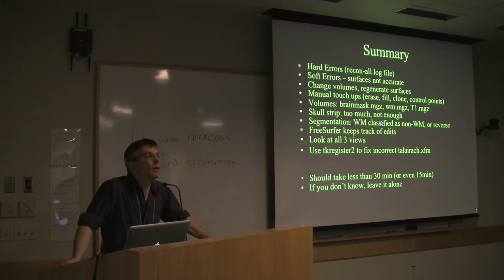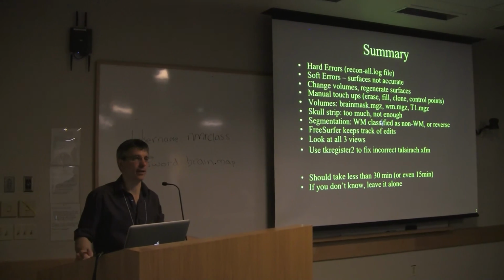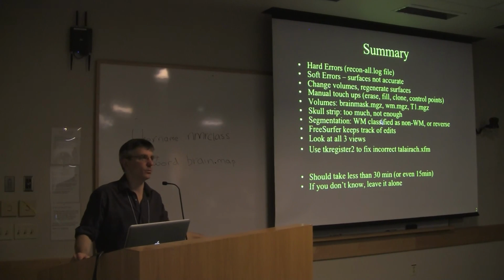Sorry, can you speak up? The version that you just gave is not what you downloaded online, unless I did something wrong. Is there another version of this? Yeah, the version that was online is the version that I usually give, which Doug evidently doesn't like. So we'll get the version that Doug gave online. The version that Doug gave is the version in the book, I think. Which was not so easy for us to change. It's easier to change what's online, and so I can do that. We literally just discovered that seconds before the talk, so I apologize for that. And by this afternoon I can have a switch.